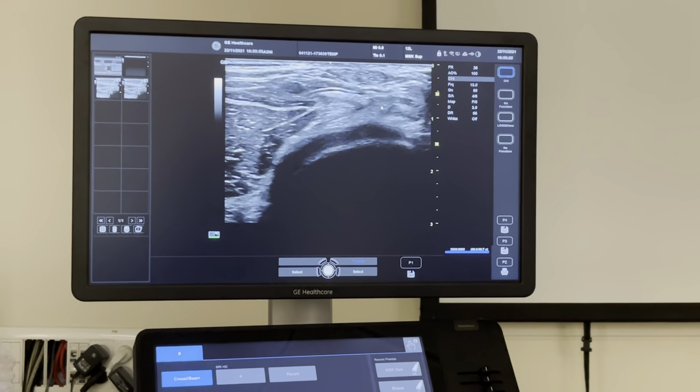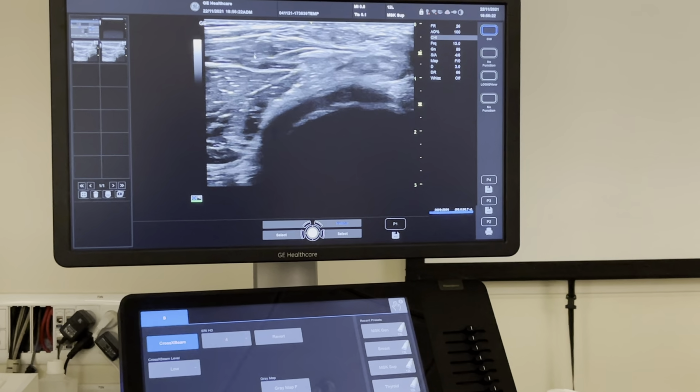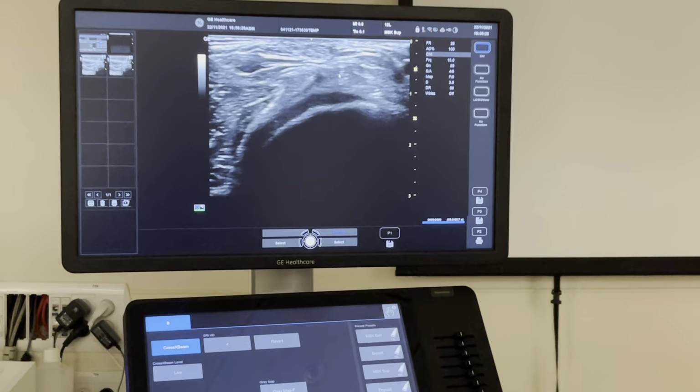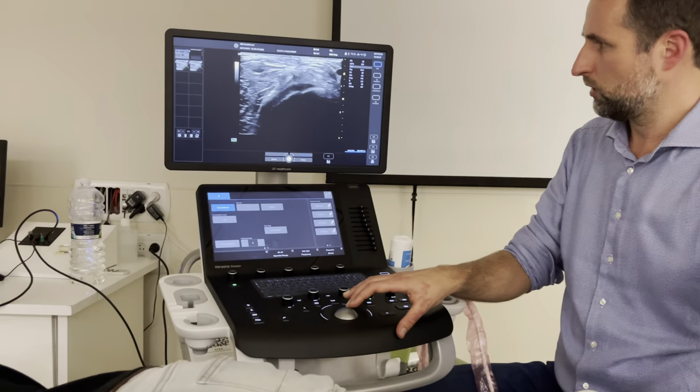Okay, so now we have identified all the tendons, we have identified the cartilage, and at this point you can see that between the semimembranosus, which is this big tendon right here, and the medial head of the gastrocnemius right there, in between there, that's where the capsule can break and fluid can come out, and a bursa will arise, and a Baker's cyst will arise, and it will usually go here superficial to the medial gastrocnemius head. One thing to note is with some people, it's impossible to get both of them hyperreflective, so I'm gonna simulate this a little bit for you, because with him it's actually quite well seen.